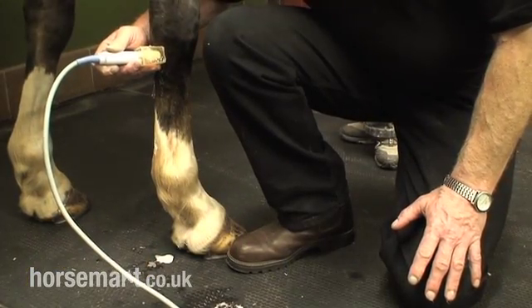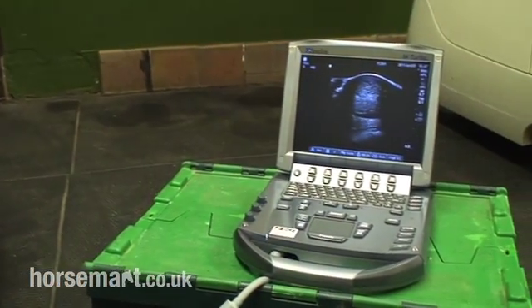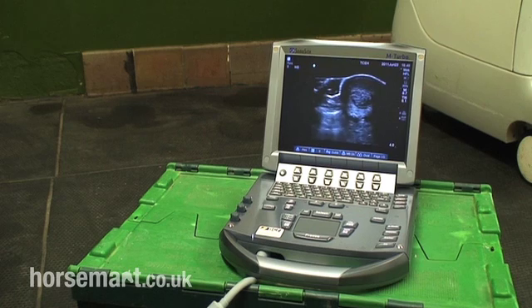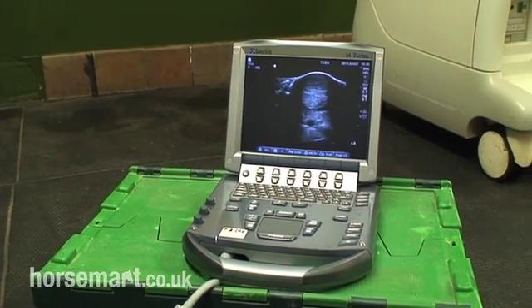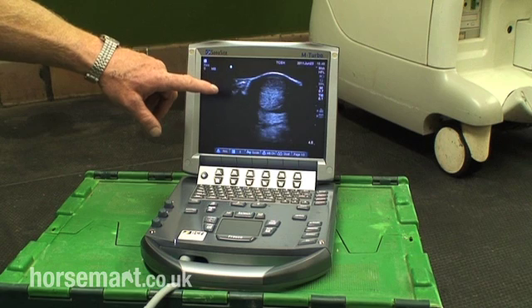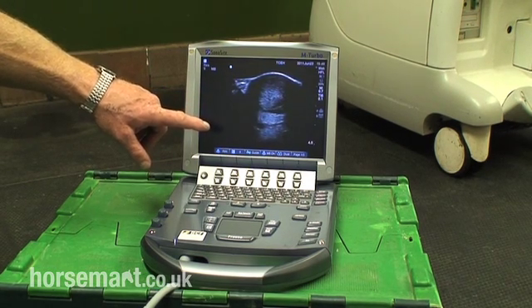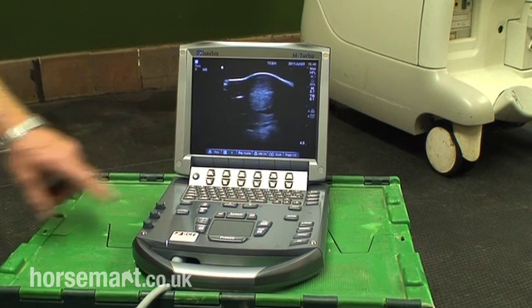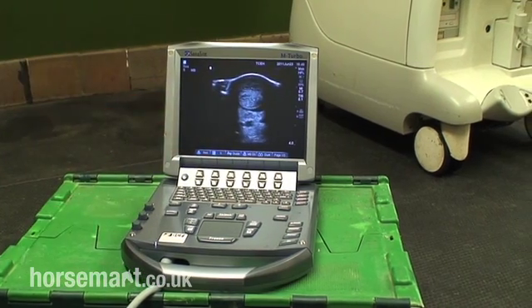We're using our ultrasound here to scan a horse's leg and we're most interested in the tissues below the knee. Those tissues will be tendon, ligament, and then lower down around the fetlock joint and the tendon sheath. The image we're getting here shows us several structures on the screen: you've got the skin at the top, then the superficial flexor tendon, the next one is the deep flexor tendon, then there's a checked ligament — that oblong type structure — and then a suspensory ligament at the bottom. At the very bottom, which we can't see on that image, will be the back of the cannon bone. So this is a cross-sectional picture. There's a blood vessel there sitting between the checked ligament and suspensory.